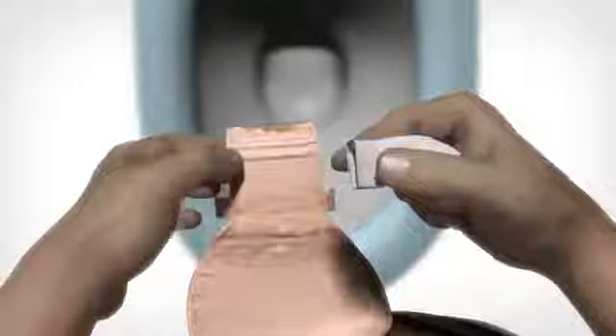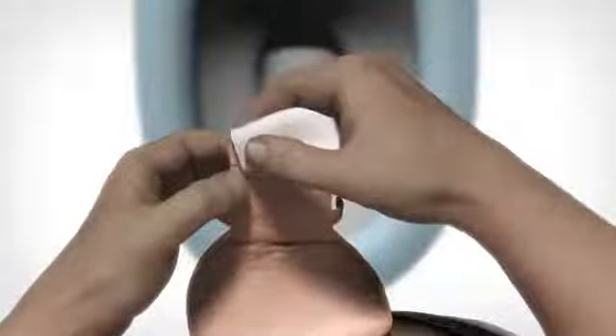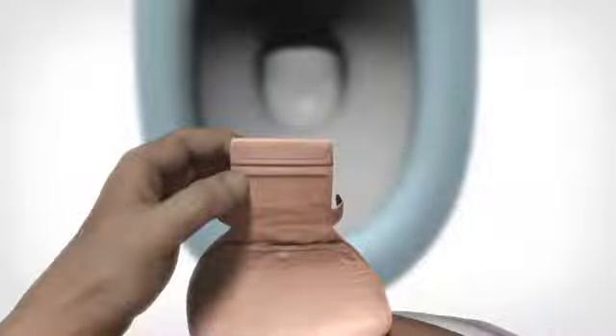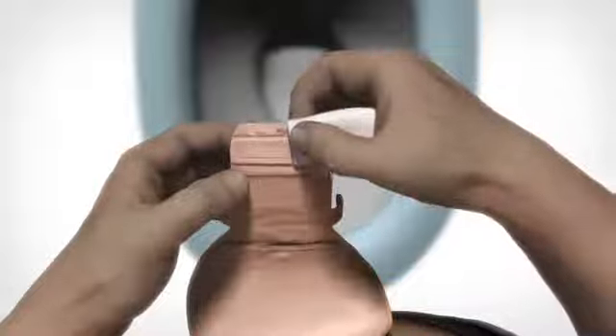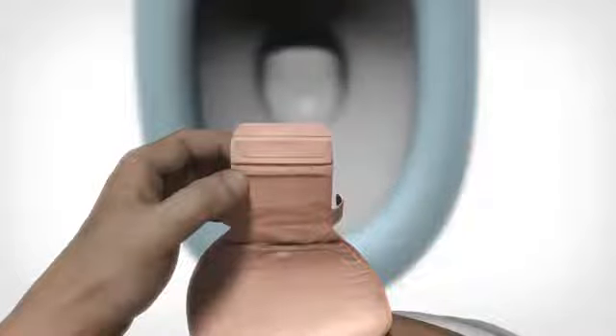When the bag is empty, clean the edge of the outlet. Fold the small plate back again and clean it in one sliding movement. The outlet is now clean and ready to be closed again.